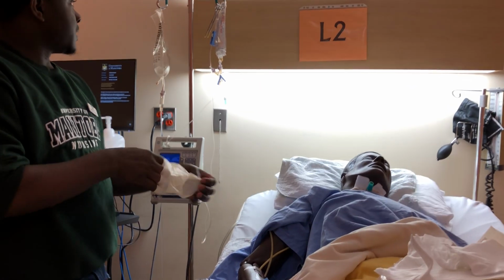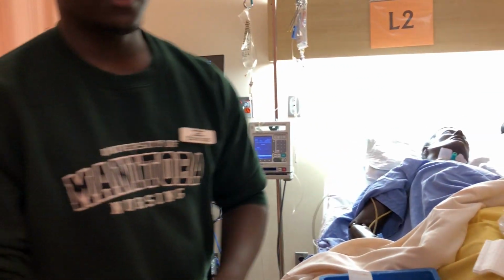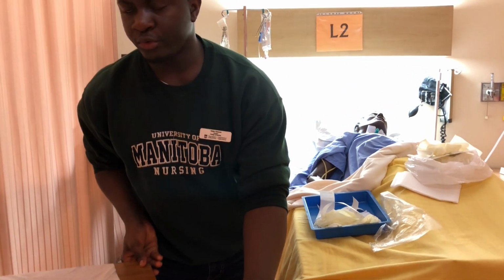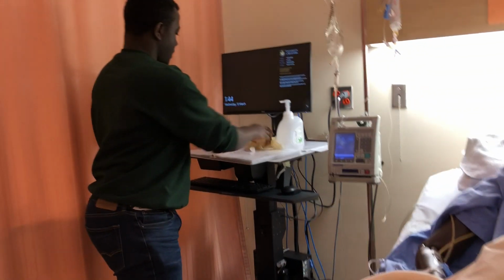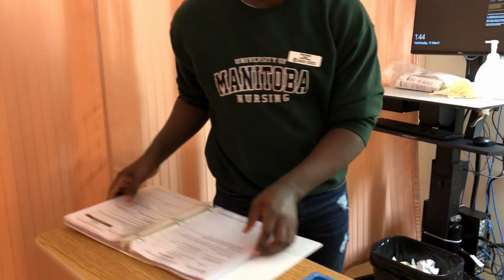At this point, I will be starting my heparin infusion. So prior to this, I had an order, and the night nurse already primed the heparin and started it. So I'll just be checking it and starting it. But to do that, I also need to double check everything to make sure it's safe.